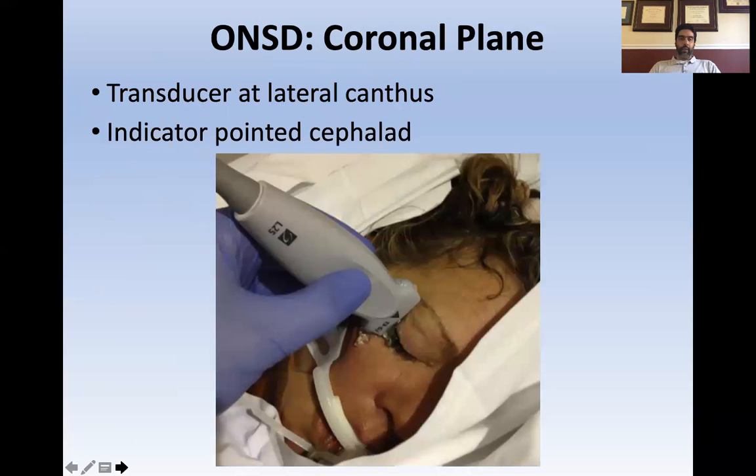Okay. There are some limitations, which I'll talk about, to measuring a tubular structure in its long axis. Anyone who has a background in ultrasound, we're always taught that if you're measuring something that's tubular in shape, you should always measure it in its transverse axis, because that way you know what the true diameter is. Okay, if you're trying to cut something through its long axis, a tube shape through its long axis, you can never really be 100% sure you're cutting right down the center, and then the diameter you're measuring is the actual diameter.